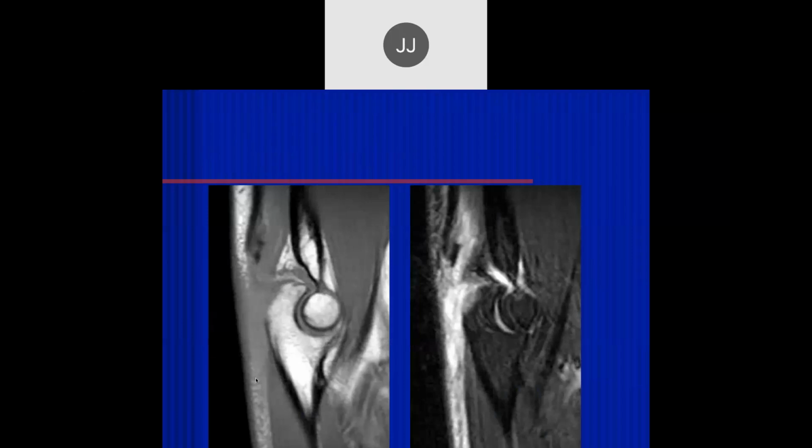Okay, so here, again, looking at the triceps, looks like there's a complete tear. The superficial fibers, adjacent edema. The bone, the olecranon, doesn't look completely intact. I'd be worried there's an avulsion there. Yeah, right there where John is pointing. And that's an easy one to fix with a couple of screws. Yeah, so this is a bony avulsion.